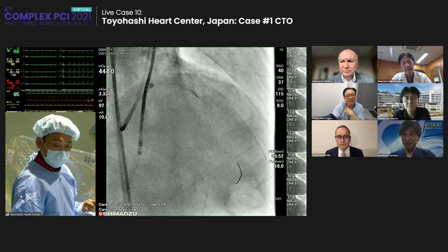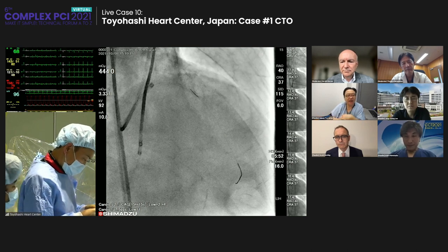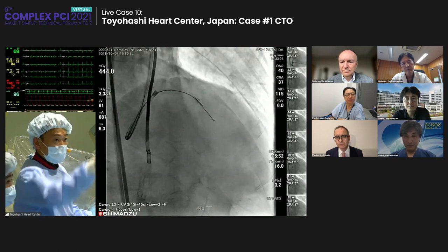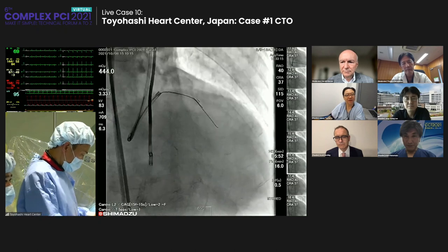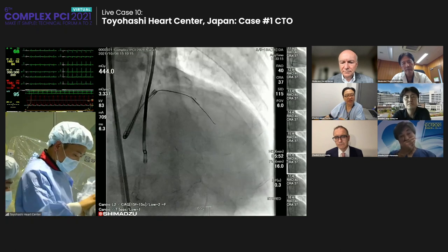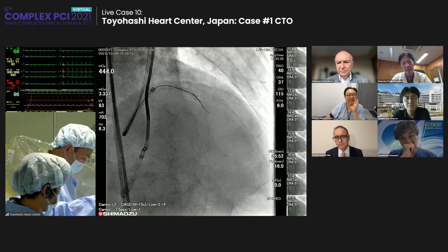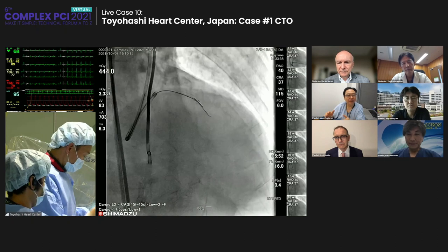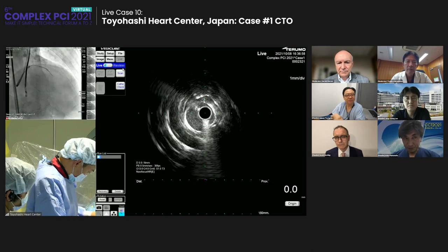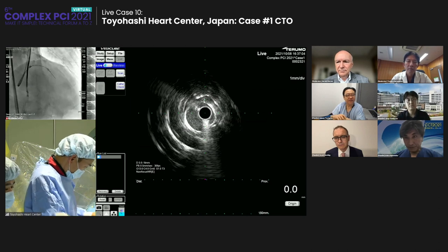I agree with you. I think I'm seeing a few more chronic ones. I suspect that when I do them, a lot of them are actually underexpanded stents. They've gotten away with it for some years. Now it pushes me to do more in all the cases I'm doing, because if it goes in right the first time, that's probably less likely to happen. I don't know. It's a combination of new atherosclerosis, even though it's some years after the original DES, like some Cypher stents. In a couple of cases of my own, I think I was undersizing. So essentially, I think that now pushes you to an imaging-first procedure, to image stents, because they're coming back a bit later. And it's a combination of new atherosclerosis, risk factors, and underdeployed, undersized stents.